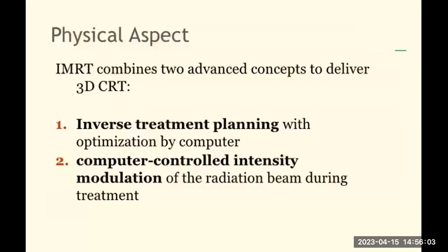On the physical aspect, IMRT combines two advanced concepts to deliver 3D CRT, conformal radiation therapy. Like this, we have abbreviations everywhere in the subject. Then they will say ITP, CCIM. It will be difficult for you to remember everything, but when you read again and again and write all the abbreviations in your notes, it helps. Even in the classes we have seen a lot of abbreviations coming in.